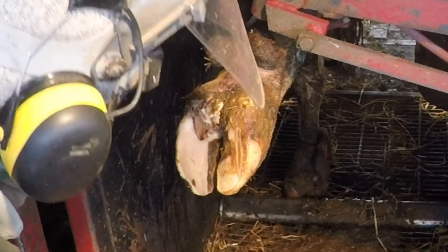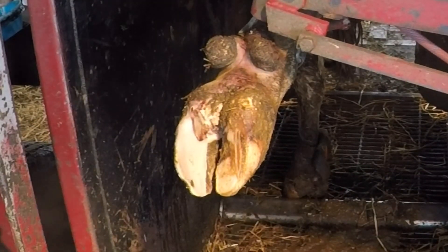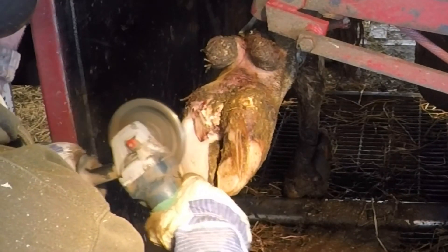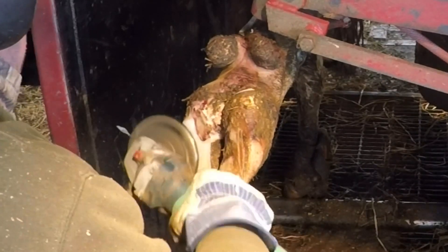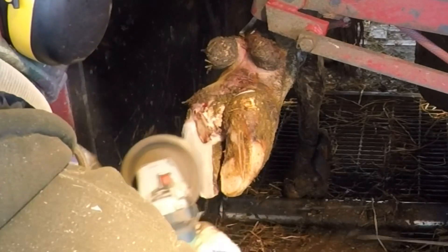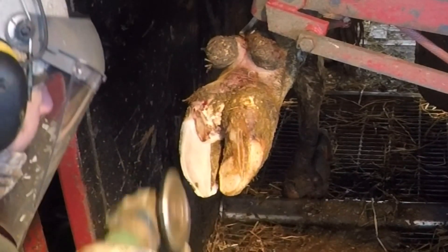As I work here, I'm paring away this loose horn, taking care to avoid any of the inner structures of the foot. Right underneath this horn that I'm removing right now is a new layer of hoof that's beginning to form. And right below that is the corium. So these are very intricate and delicate structures that you've got to be real careful when you're working around.